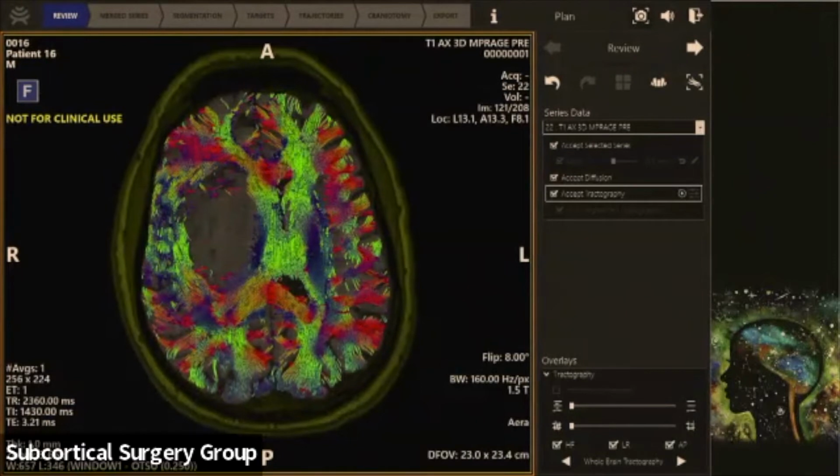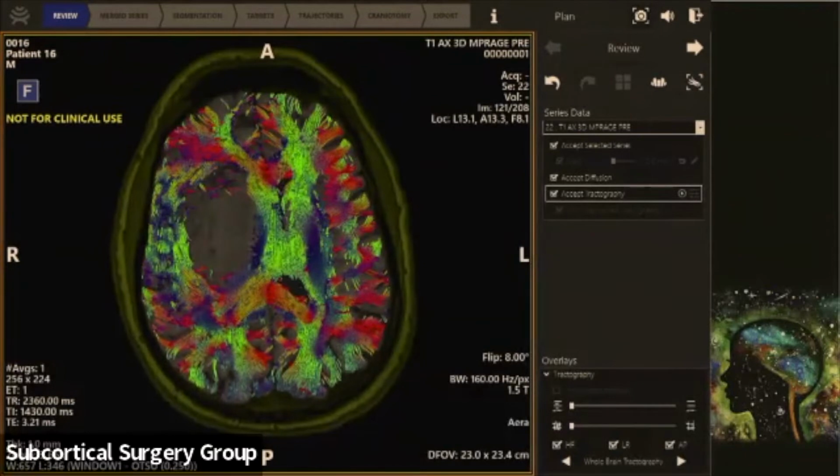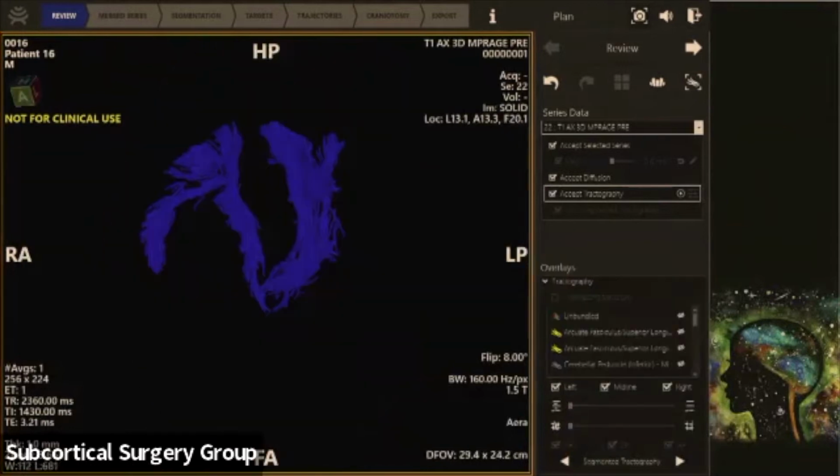And the fiber tracts now are tight around the edema and can tell us that, in fact, in this region here, the water that we see there isn't water, but it's edematous brain, and those fibers can be salvaged. And it allows us to see this very tight corticospinal tract packed around the hematoma, so we don't stick our suction or cautery in there intraoperatively.